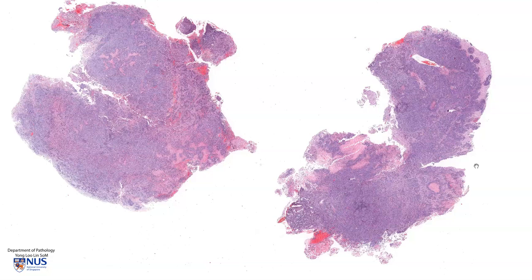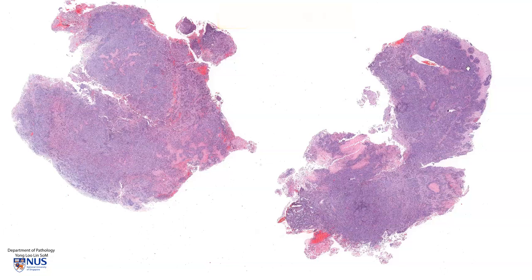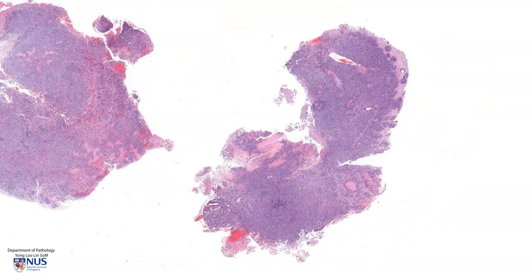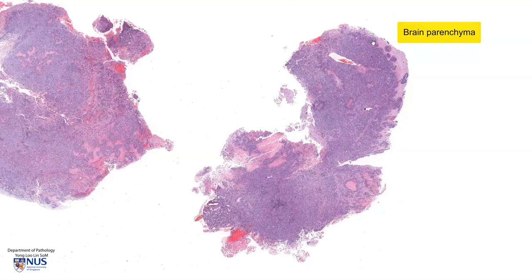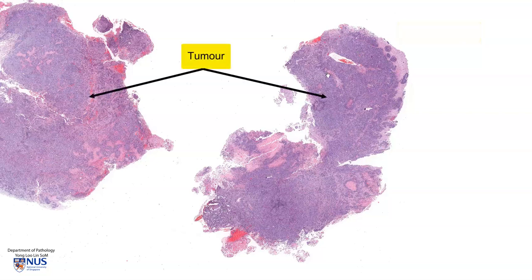Hello, this is a virtual microscopy slide of a tumour that has been excised from the brain. We have two pieces of tissue here. Over on the right side, we can see there's a little rim of pinkish appearing tissue, and this is some of the residual benign brain parenchyma. However, the majority of the tissue is composed of these sheets of very bluish appearing cells, and this is the tumour.